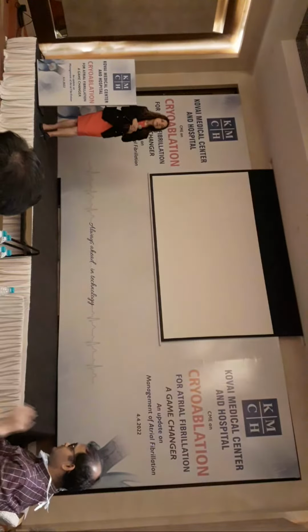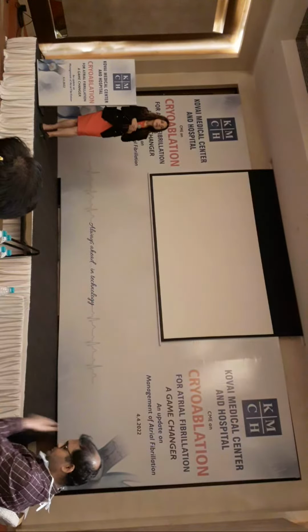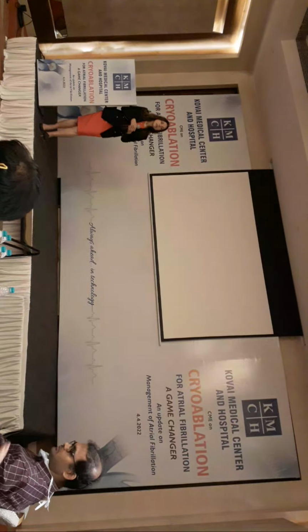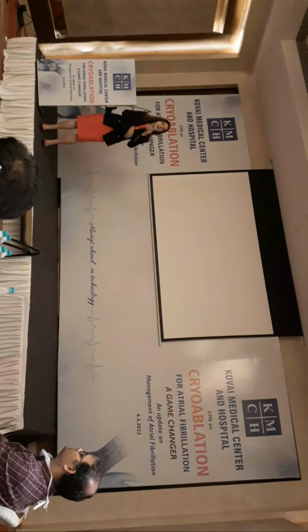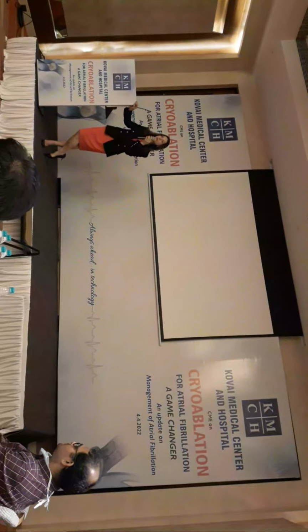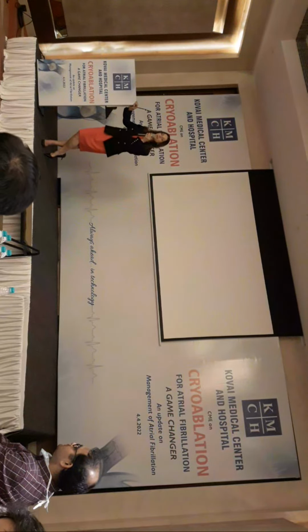Thank you and very nice cases today. I have a quick question on the phrenic nerve. How did you monitor the phrenic nerve today? Sometimes in the recordings we get a lot of noise on the diaphragmatic potential. So do you need someone to stand there and have their hand on the phrenic nerve, or can you go by the potential? Yeah, so there's so many ways of doing it, but this is the way we usually do it.